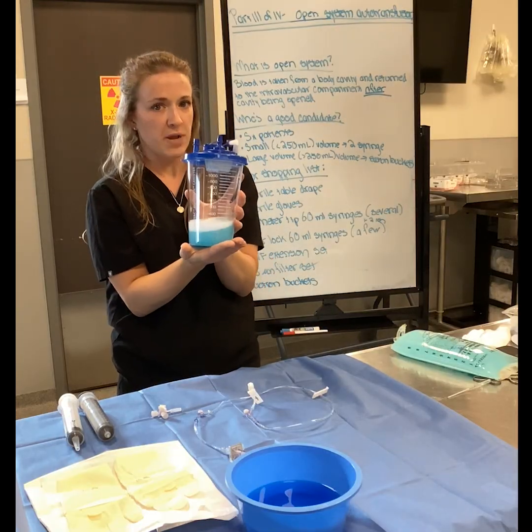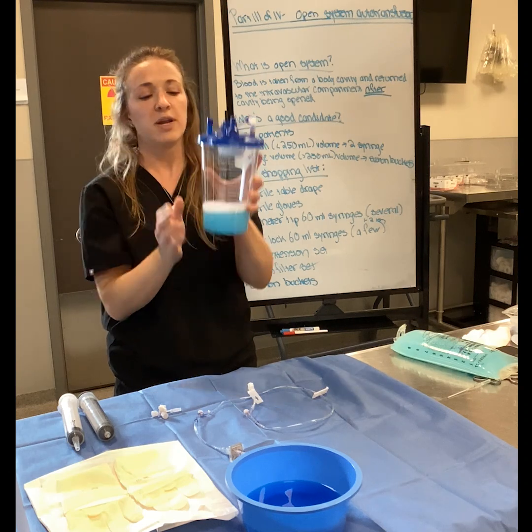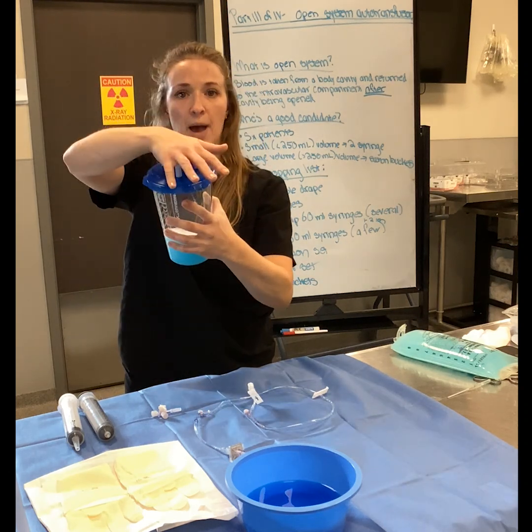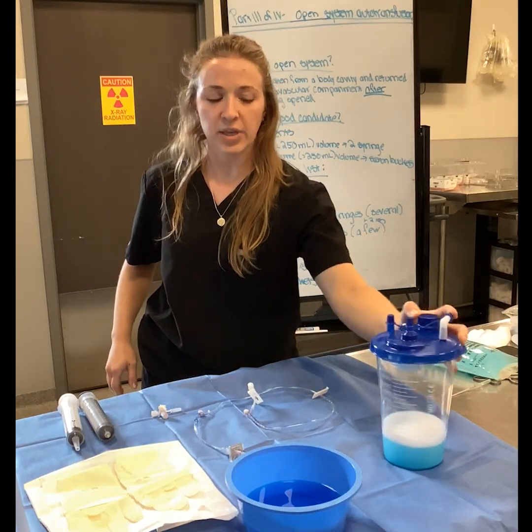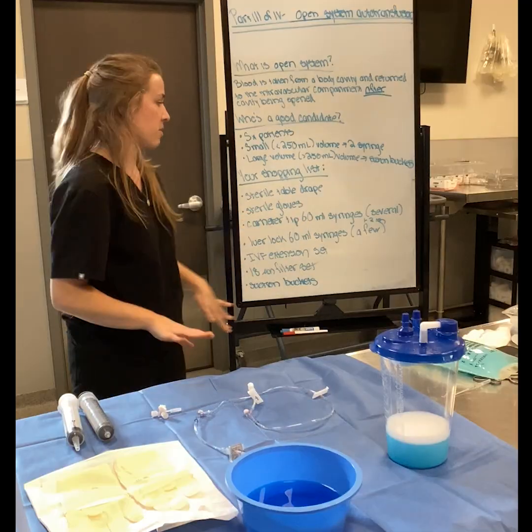But if you have a large patient, greater than 10 kilos, or it has a huge effusion, this is going to be the fastest way to get the blood out of the body and then capped off to keep it nice and clean in order to get that prepared for delivery back to the patient.